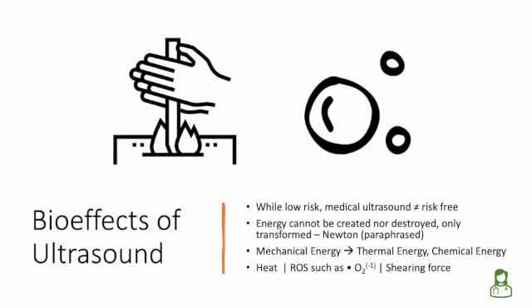And while most of the time this is a very minimal heat generation because of the settings of our machine, the effects of our blood redistributing heat very effectively as it flows through our bodies, and because our machines have been set up to minimize the amount of time that echoes are actually being transmitted into the body and being received. That being said, these things still do happen.